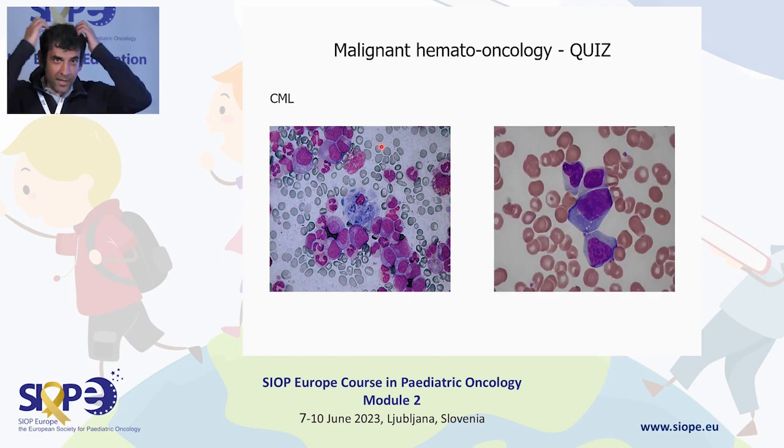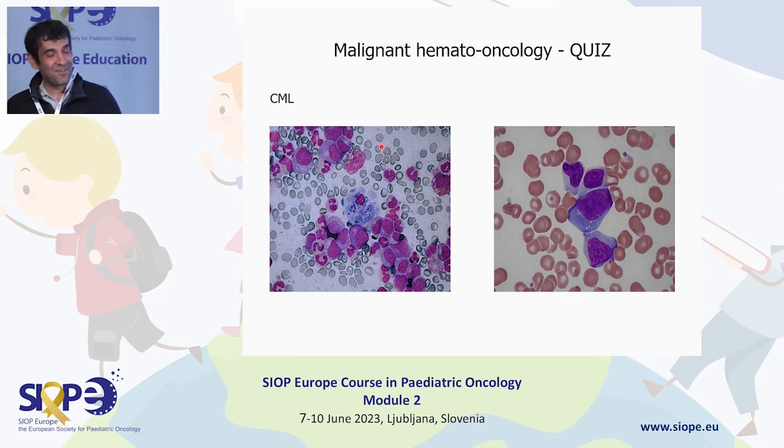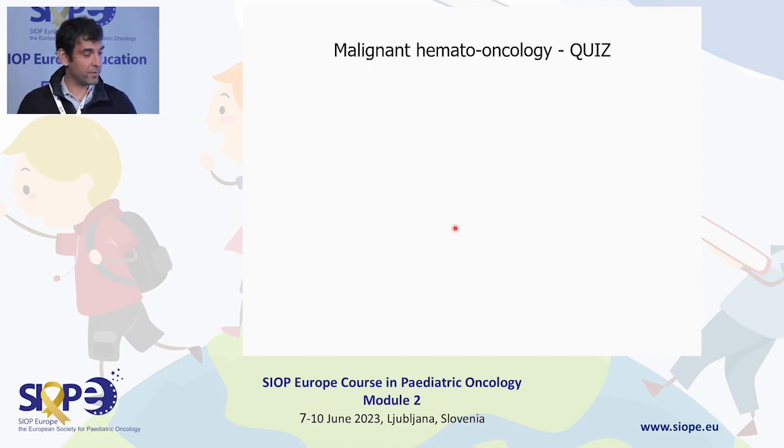This patient, an adolescent boy, has had a girlfriend for 2 weeks and came in with lymphadenopathy and hepatosplenomegaly. What does this patient have? And what kind of cells are here? EBV, yeah, these are Pfeiffer cells. It's very important to recognize activated lymphocytes in virus infections, and they can even look like this. Activated or monocytoid lymphocytes, right.